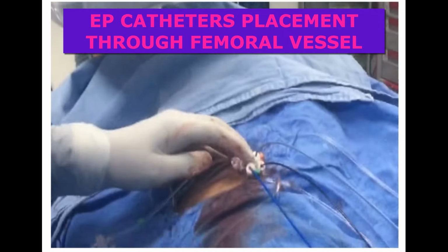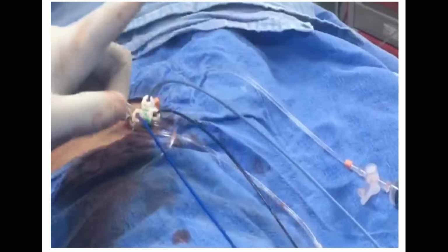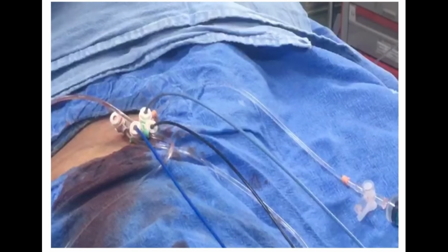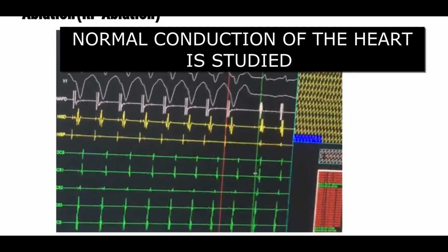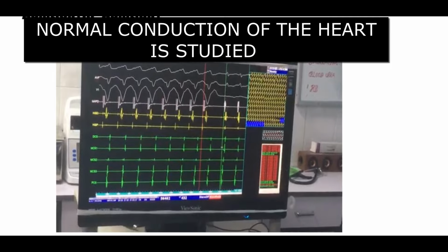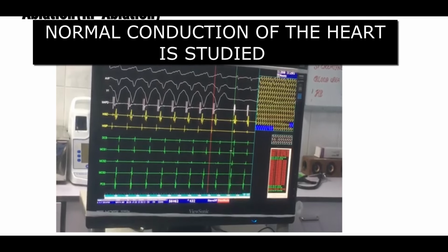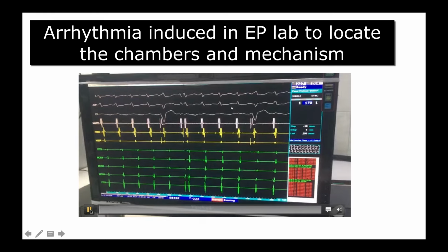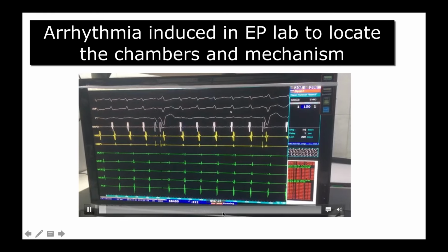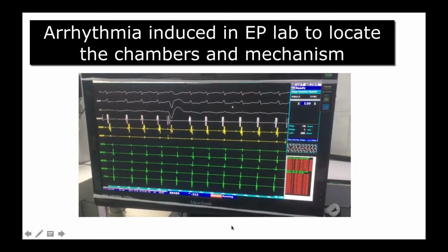Now we have punctured the femoral vein, and we are going to position all three catheters inside the heart. Through fluoroscopy we see the location of these catheters, and through the computer system, which we call the EP system, we see where the catheters are and how the current flows from the SA node to the AV node, and what the behavior of the electrical activity is between the right atrium and left atrium, which is coming early, which is coming late, and whether any abnormal pathway or abnormal circuit, meaning an insulation breach, is there or not.